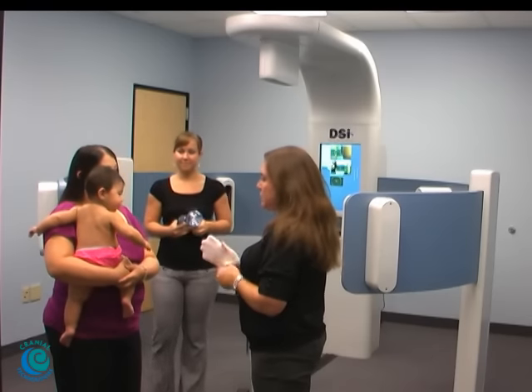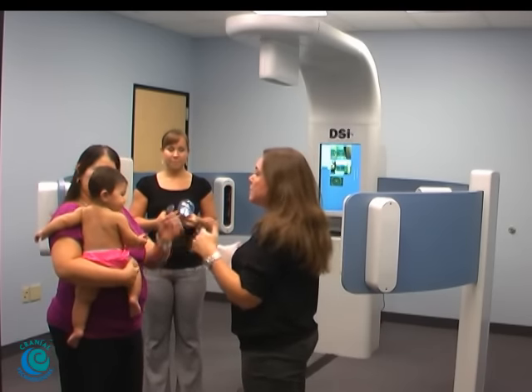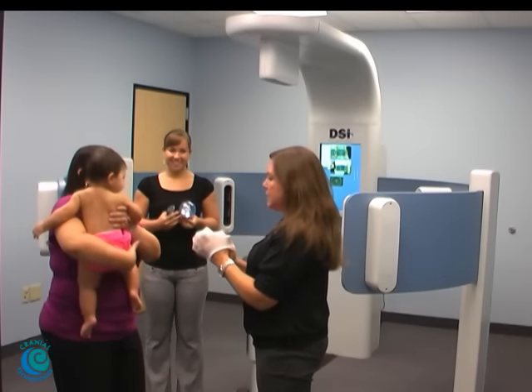So what we're going to do today is we're going to take an image of her head. I'm going to be putting the stockinette over her head. It's going to keep her hair nice and smooth, and it'll give us a nice smooth image. She can still see and hear and breathe and all those good things.